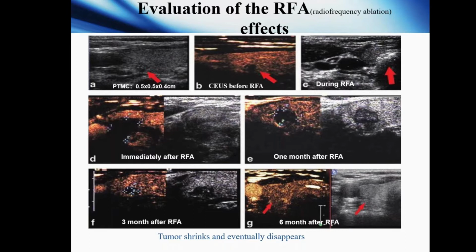CEUS before radiofrequency ablation showed heterogeneous low enhancement in this nodule. This strong echo during radiofrequency. The tumor was evaluated immediately after RF.